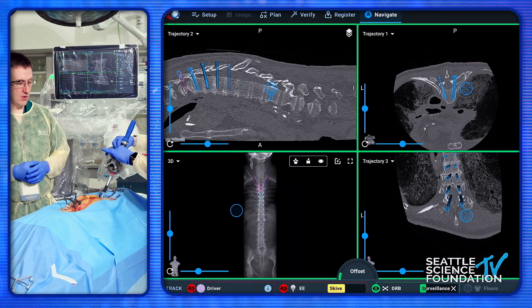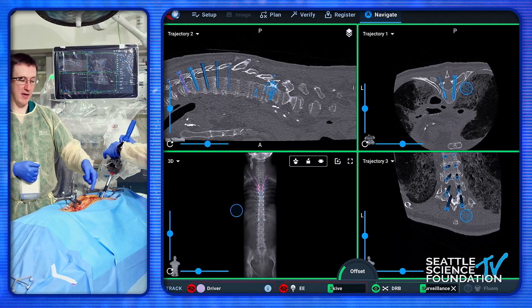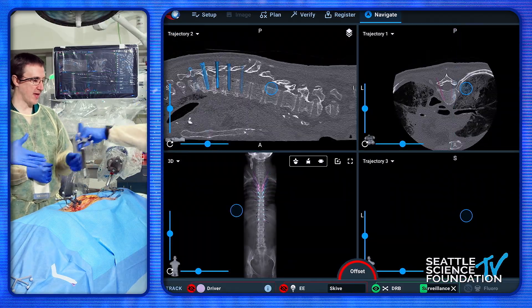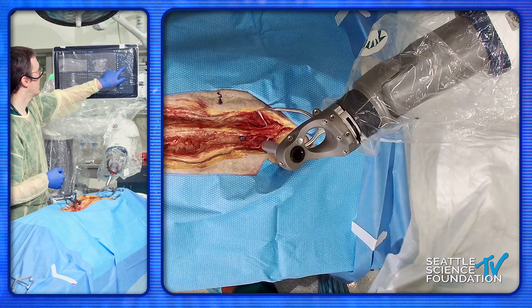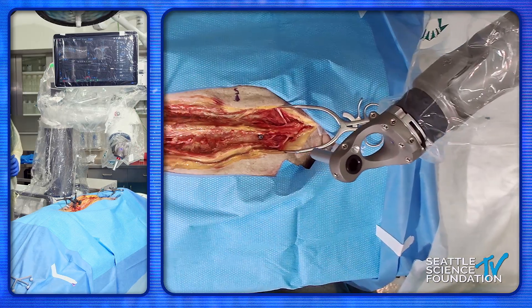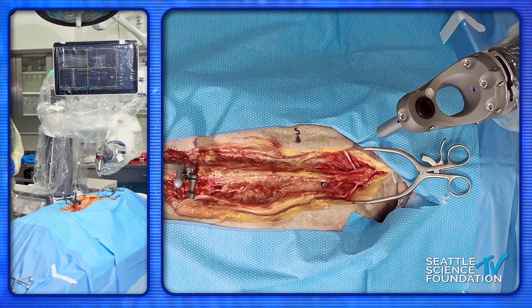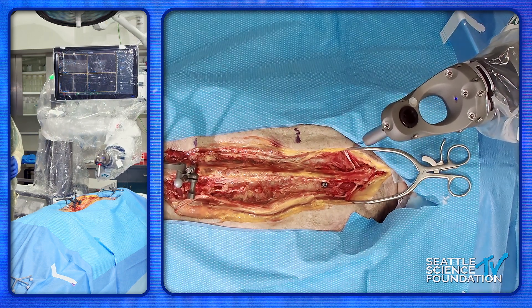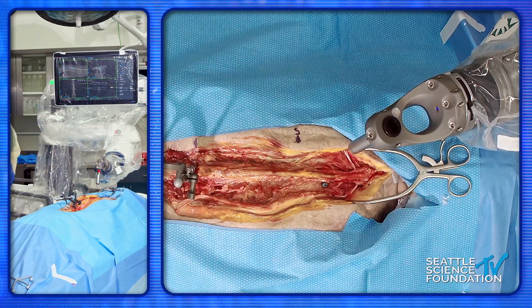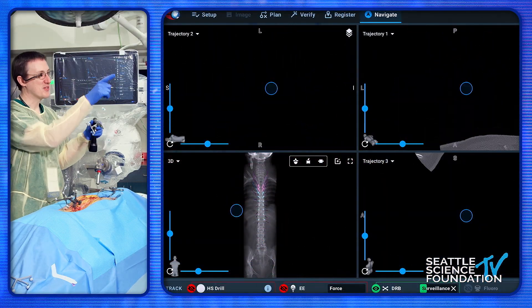I talked a little bit about the serpentine pattern where we weave ourselves back and forth starting from the top, more towards our array. The reason for that is you can pull the body from side to side doing that. This will help compensate for it. There are instances where for technical reasons you might need to do a couple in a row on one side — that's fine, just be aware that the body is getting pulled towards you.